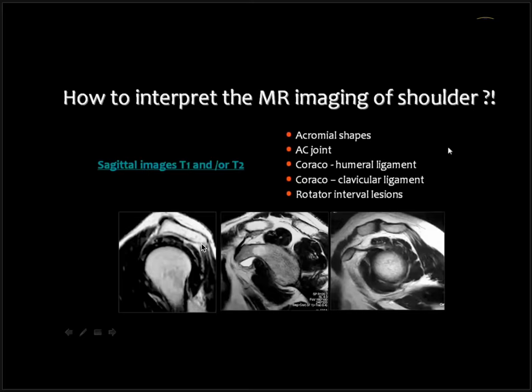On sagittal sections: the acromion shape allows us to apply the Bigliani classification — type 1 is flat inferior, type 2 is curved concave inferior, type 3 is hooked inferior, type 4 is convex inferior. We can see all the muscles: supraspinatus, infraspinatus, teres minor, and subscapularis. We can see the coracohumeral ligament, superior glenohumeral ligament, middle glenohumeral ligament, and inferior glenohumeral ligament. We can also talk about acromioclavicular osteoarthritis, and subcoracoid bursa and subscapularis bursa.